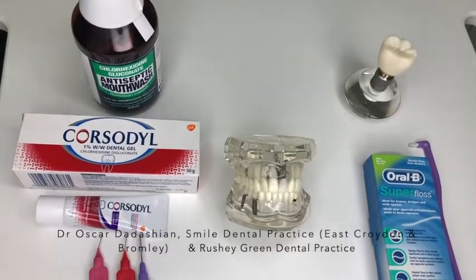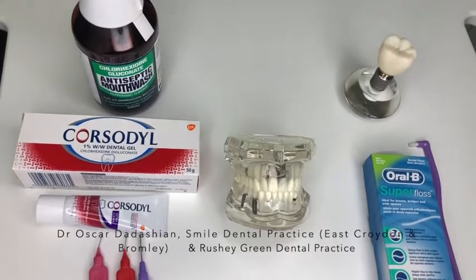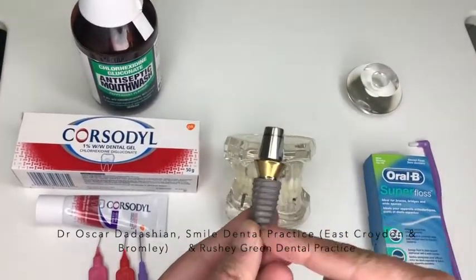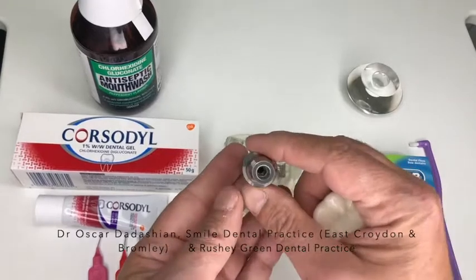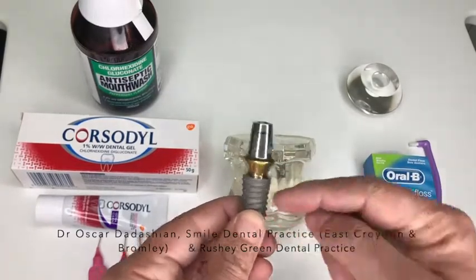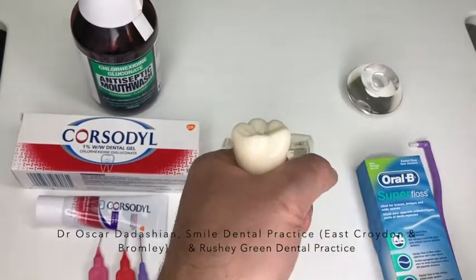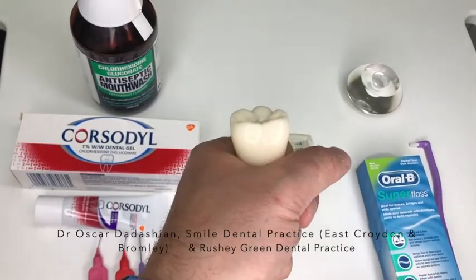Now, what if your implant retained crown or bridge feels loose? Often patients get really worried about it when it gets loose. Now, as you know, implants are made of three parts: the implant itself that's embedded into the bone, and then you have an abutment that is screwed in through that hole. So that abutment is screwed into the implant through a screw going there, and then the crown goes on top. Remember, all this is underneath your gum, and when it starts feeling loose, you panic, you don't know what's loose, and you think the worst.